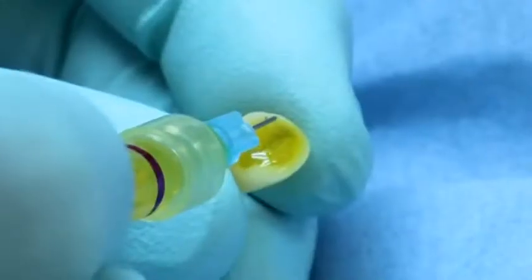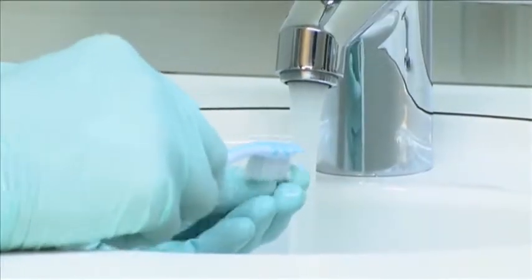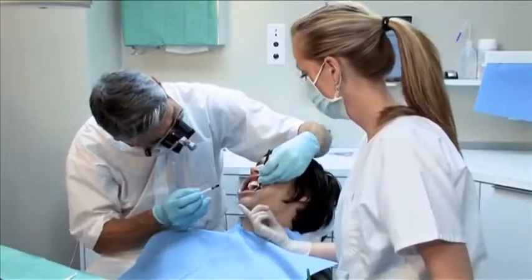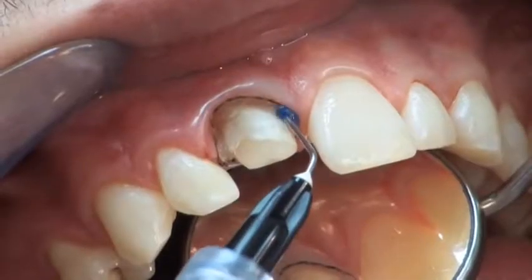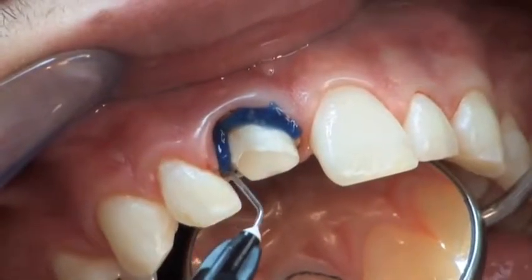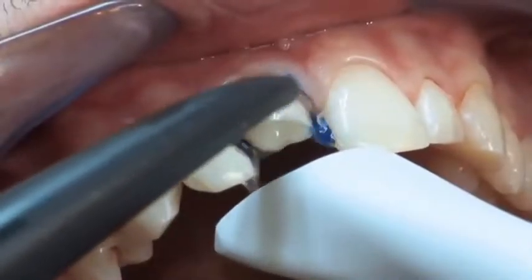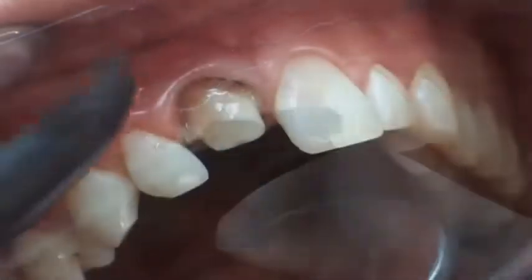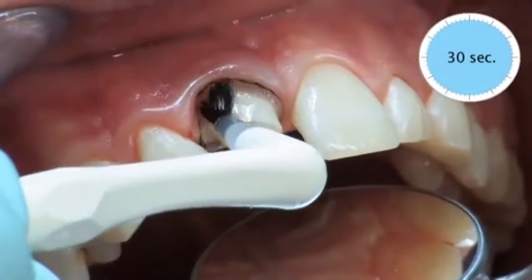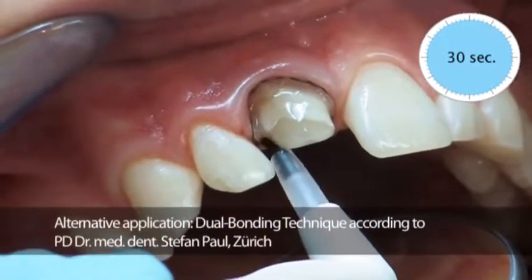Before cementation, the inner surface of the crown is etched with hydrofluoric acid, cleaned under running water and dried afterwards. The etched surfaces are silanized and thoroughly dried. Etching around the margins of the preparation using 35% phosphoric acid is now performed. The etchant gel is rinsed off thoroughly and the tooth is gently dried. Reapplication of Parabond adhesive shortly before the final cementation significantly increases the retention of the ParaCore cement.